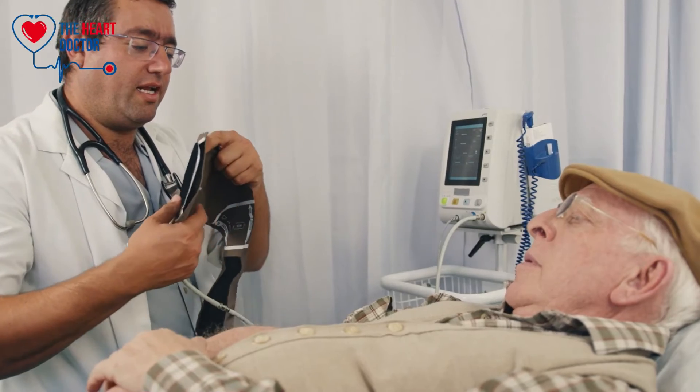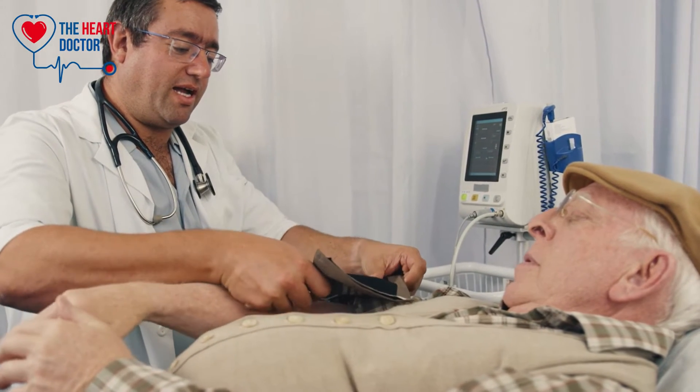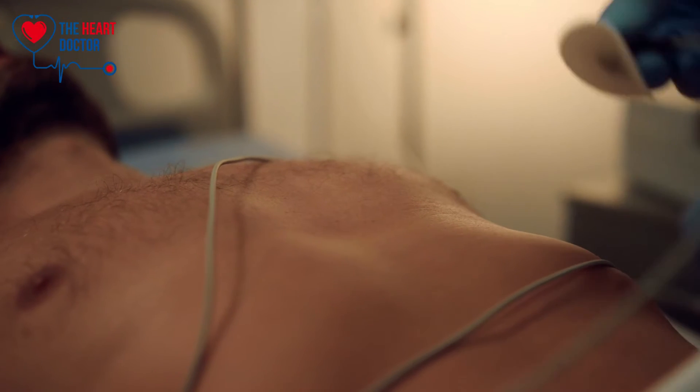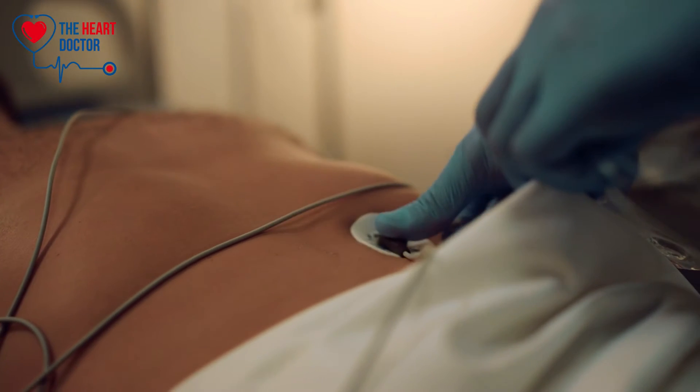As this is the most common type of echo, I will talk you through what happens in the hospital if you're having this test done. When you arrive, you'll be given a hospital gown to wear as you will need to remove all your clothing from the top half of your body. You will have your height and weight measured, as these are important to interpret your scan results. You will also have your blood pressure measured, as this is useful information when reporting your scan. During the scan, your privacy will be maintained — you will be in a hospital clinic room in the outpatient department with the curtains drawn. You'll then be asked to lie on a couch and electrodes will be attached to your chest using small sticky dots to monitor your heart rate and rhythm during the scan.